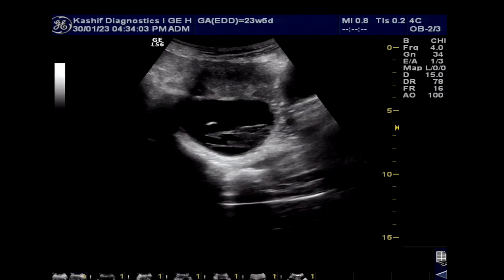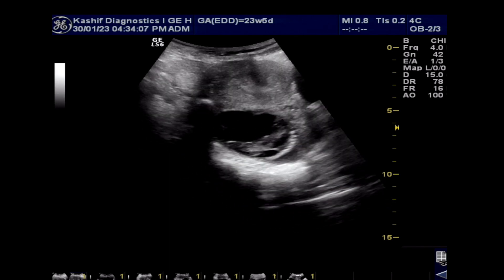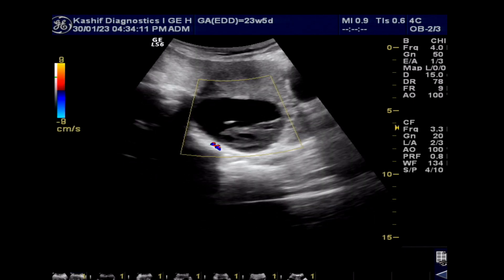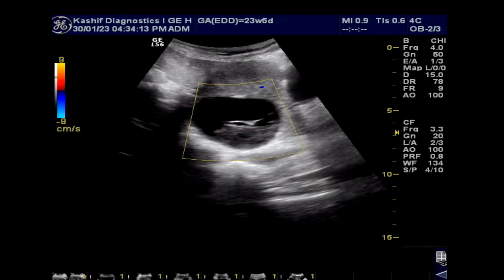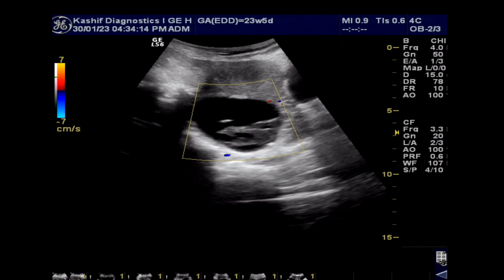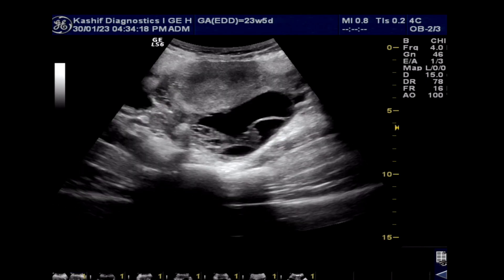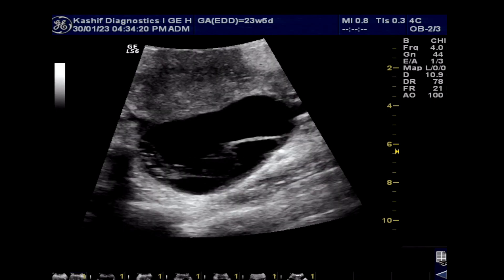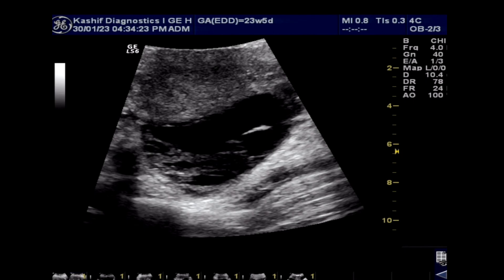Hemorrhagic cysts have many appearances on ultrasound, and this is one such appearance. This is a trans-abdominal scan of the pelvis. Hemorrhagic cysts can occur in young unmarried girls and married women. This trans-abdominal scan shows that if a clear image is obtained, there is no need for an unnecessary transvaginal scan.